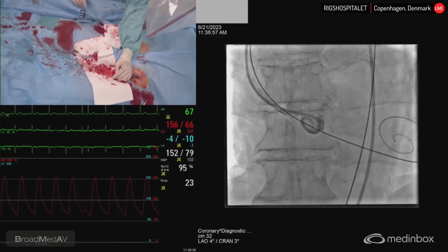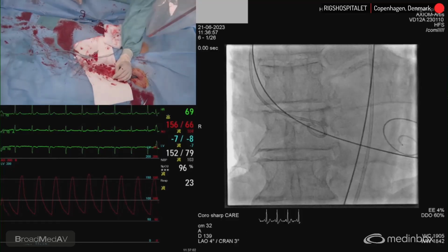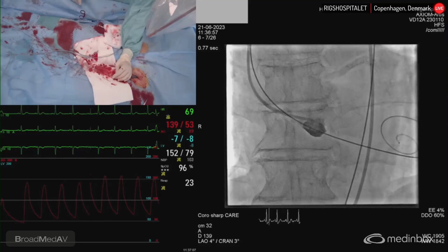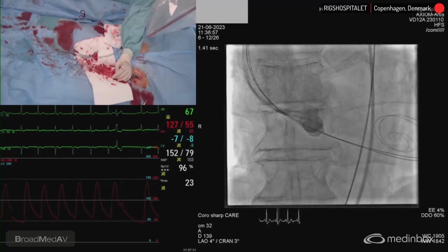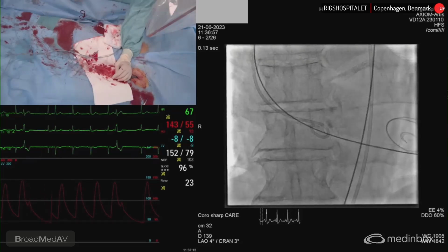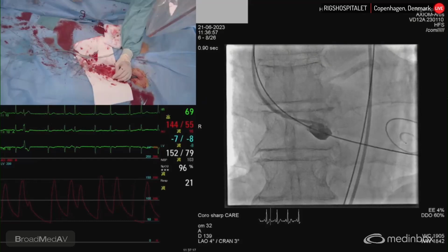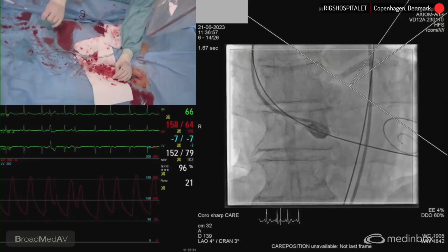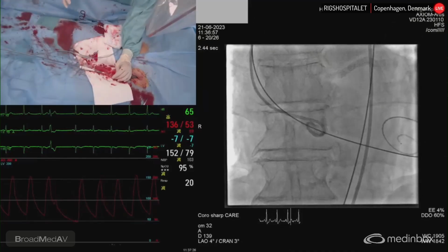This is the tricuspid view. And let me see, tricuspid view, wide. It looks good to me. Yeah. Okay, we can stay in this angle for now. Yep, all right. But here you see clearly we have the very vertical annulus. Yeah. All right, so somebody holds wide, please, 6 o'clock.